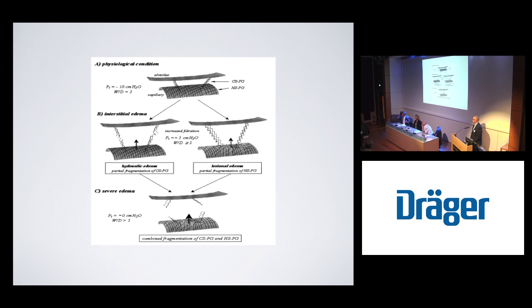So what that really means is that CPAP is a mode that is as simple as it gets. There's no trigger. There's no complication, really, of having to deal with anything. So basically, you can apply this early. And my overall feeling is the key thing is to prevent further heterogeneity.